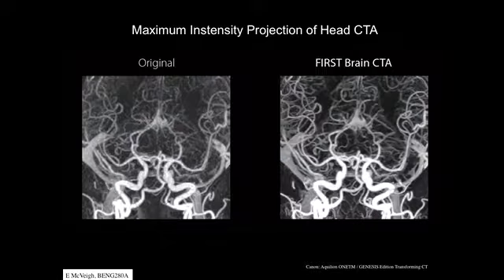And just display that. And so that is a form of projection of the data. You need 3D data to do it, but it's called a maximum intensity projection. It gives very stark contrast between the vessels in the background. And you don't pile up signal as you go through, right? So to do that, you need 3D data.